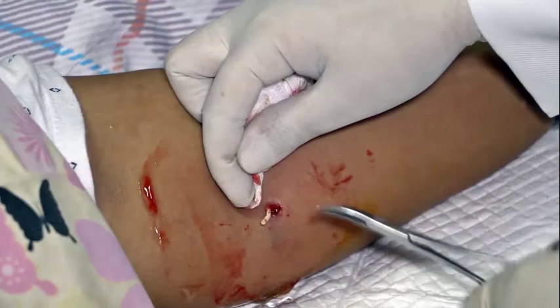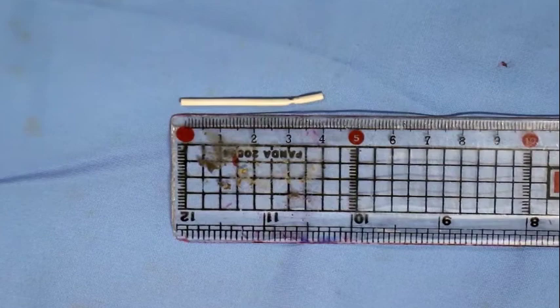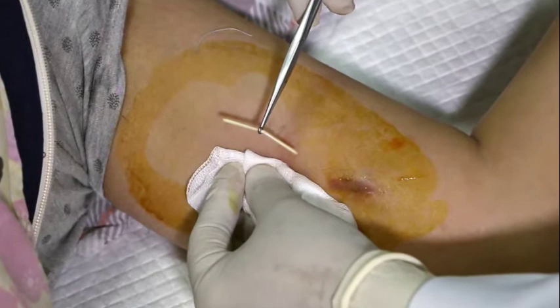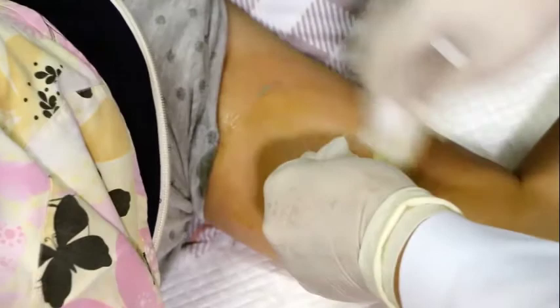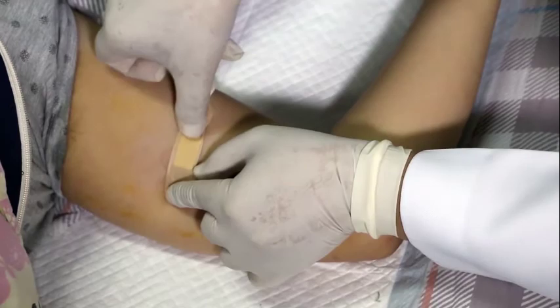Measure the implant and confirm the whole rod has been removed. A single rod implant is 4 cm long; a two-rod system ranges between 4.2 and 4.4 cm long. Here we demonstrate the successful removal through a separate incision site, different from the insertion site. The previous failed removal attempt resulted in the scar visible here. Obtain hemostasis and cover the incision with a 4x4 gauze and clean the remaining antiseptic off the arm. Close the incision by bringing the edges together with a sterile skin closure or suture depending on the size of the incision. Apply pressure bandage dressing to minimize bleeding and bruising.